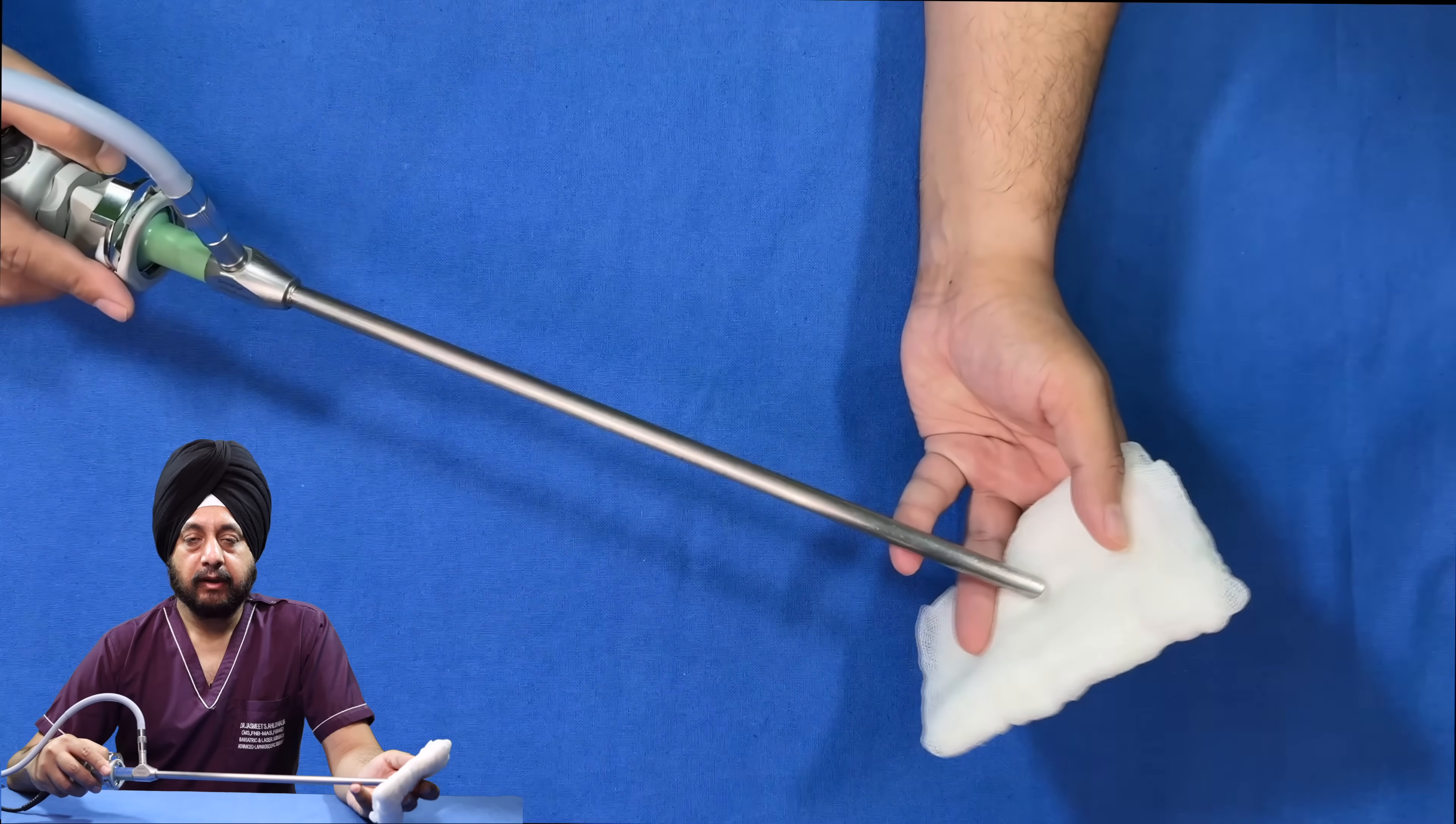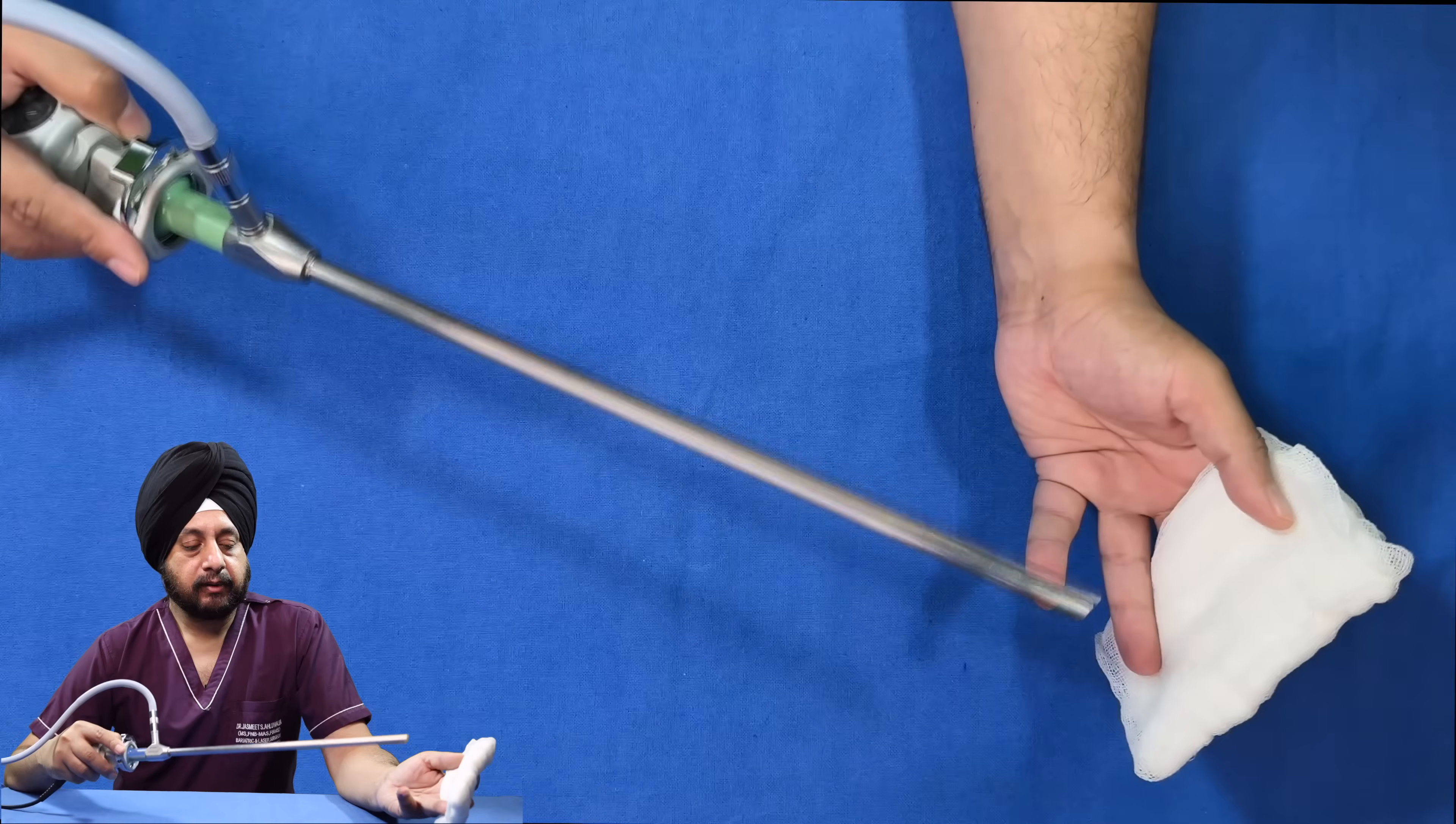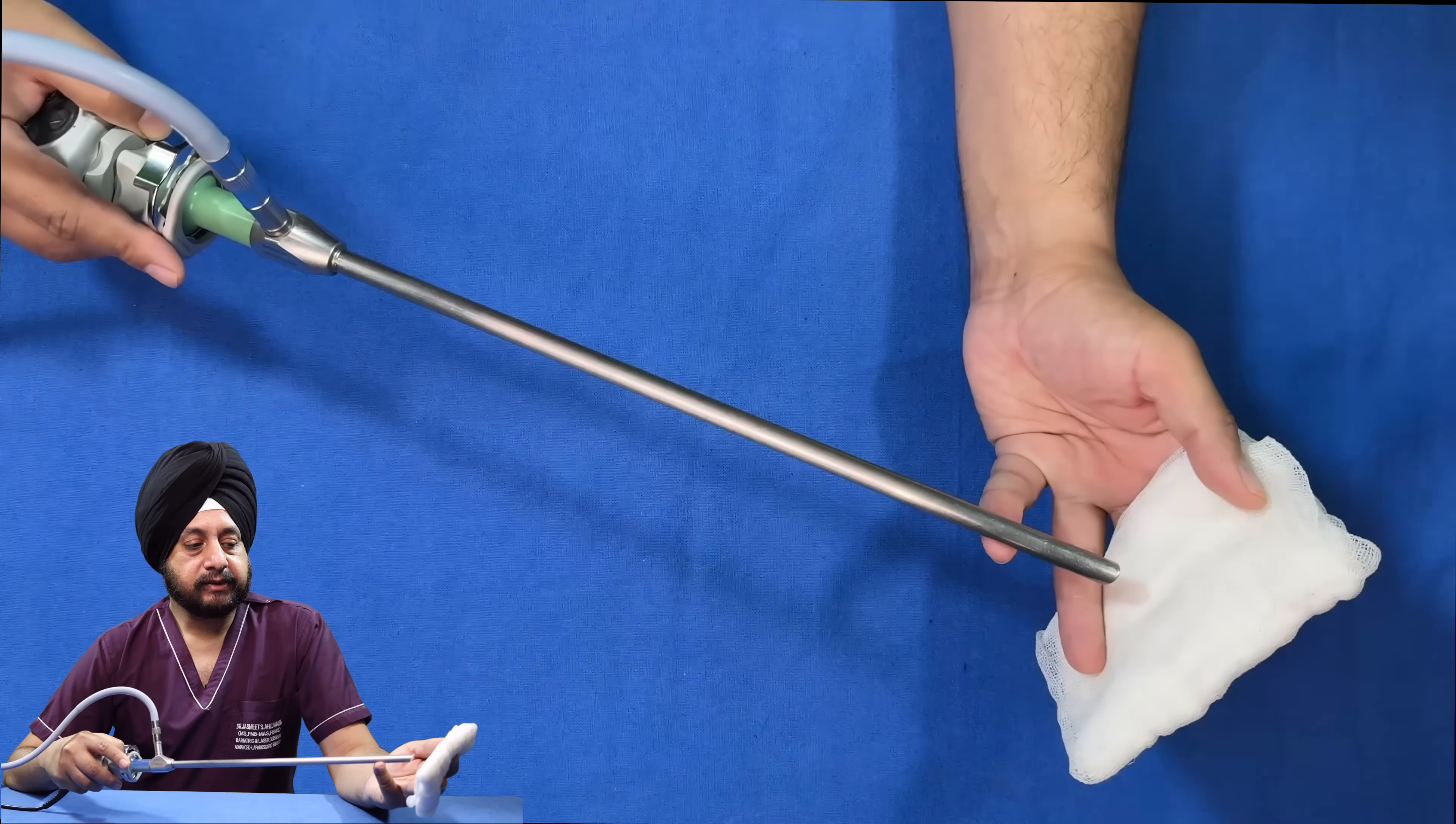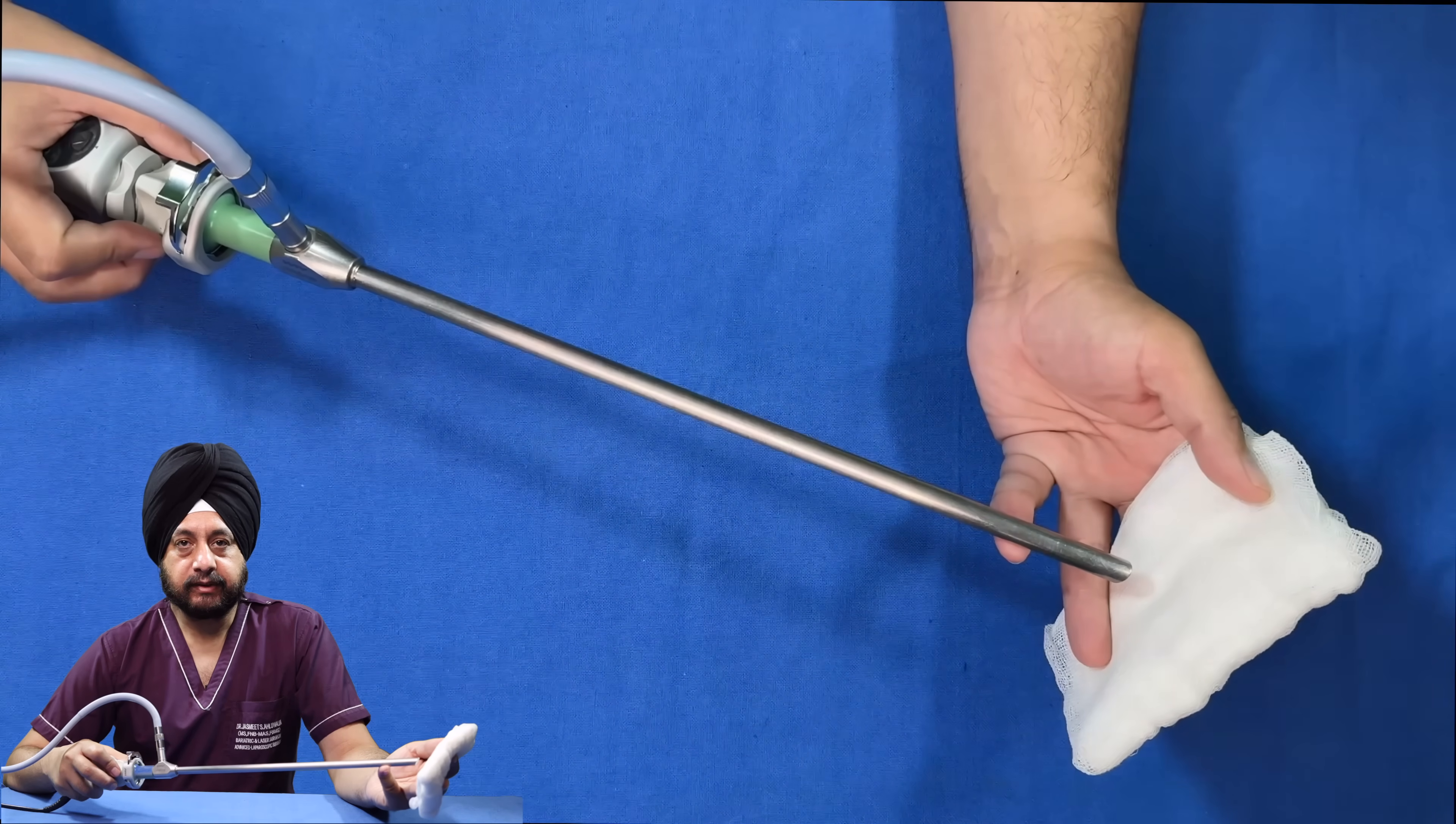When doing white balancing, ensure that the white cloth like this gauze or pad is covering the entire screen of your monitor. Keep your scope at a certain distance and support it with your finger so it doesn't move. Keep it at a distance so that the gauze is properly focused by rotating the focusing system and the entire screen is covered by white gauze.